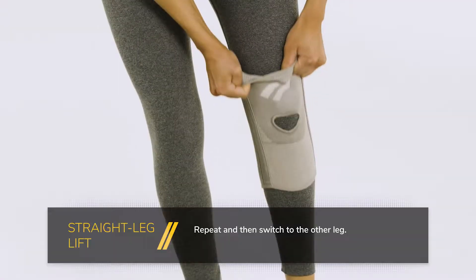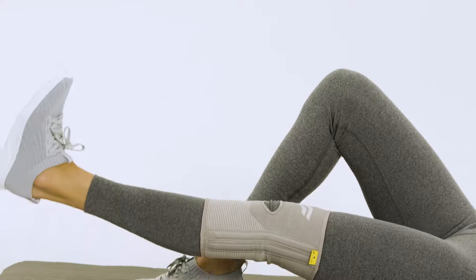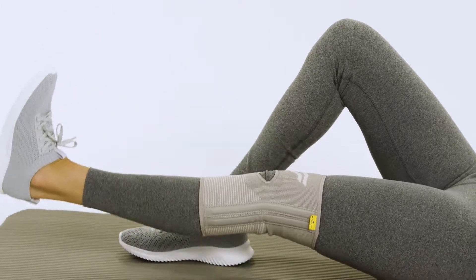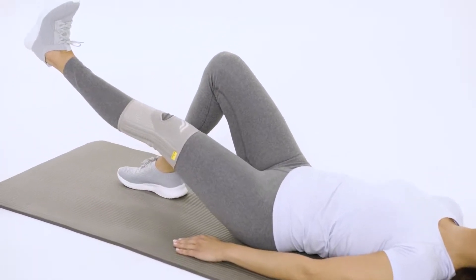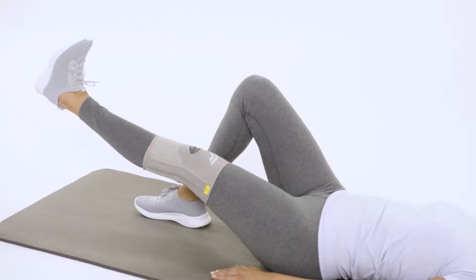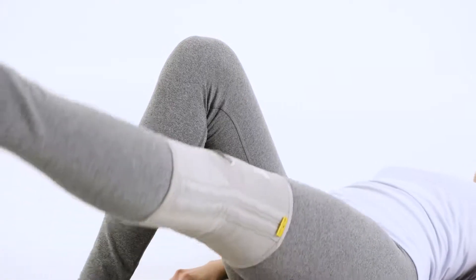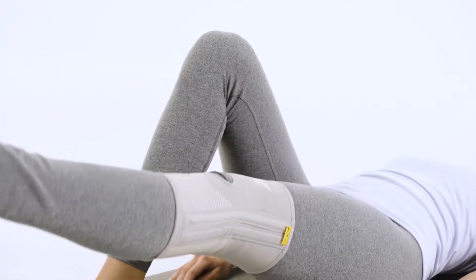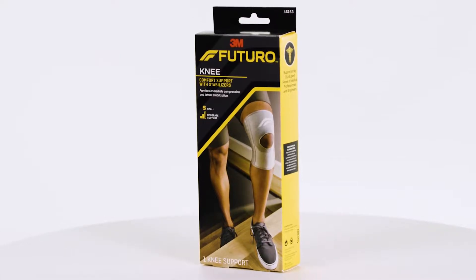A knee brace may provide added support and increase your awareness of your knee's position while performing higher level activities. Futuro Comfort Knee with stabilizers is specially designed to offer you all the support you need, with side stabilizers that reduce lateral motion and enhance support without limiting your mobility. Plus, it's made from four-way stretch fabric that fits easily under clothing and is comfortable to wear all day long.